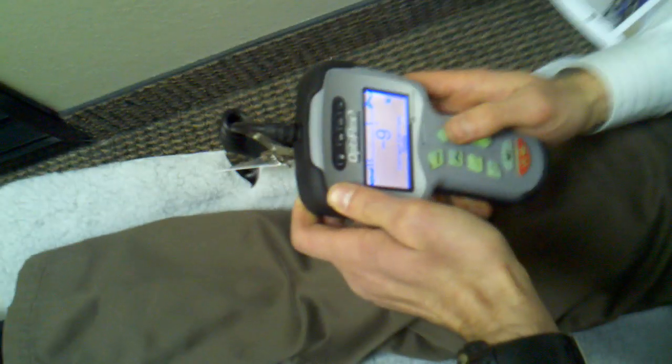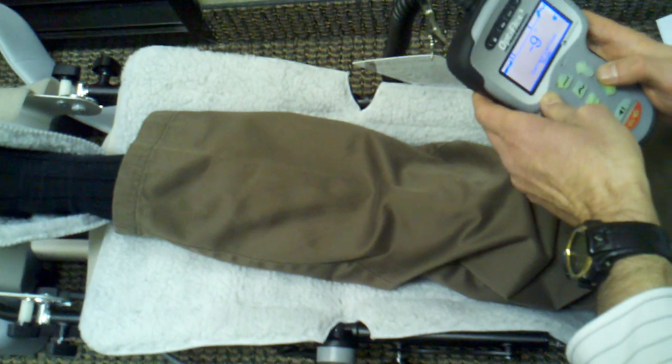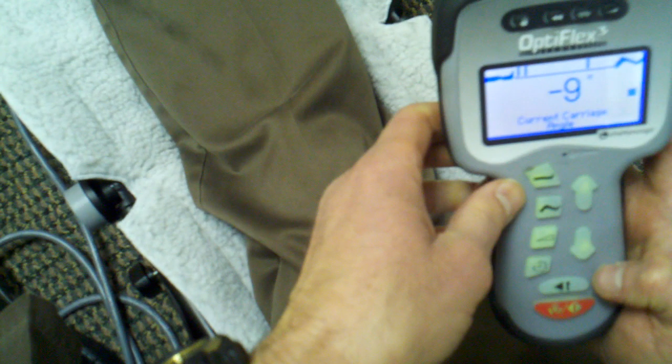What it will do is go back and forth. This is the electronic device that allows you to set the flexion or extension angle. Once you set it, you'll be able to push start and it will move the knee in the continuous motion.